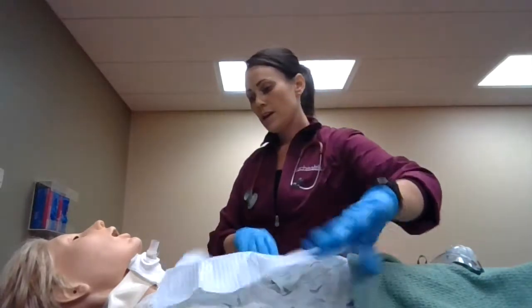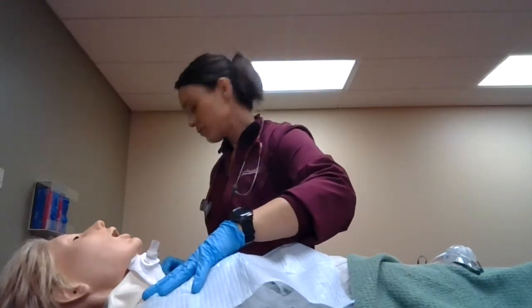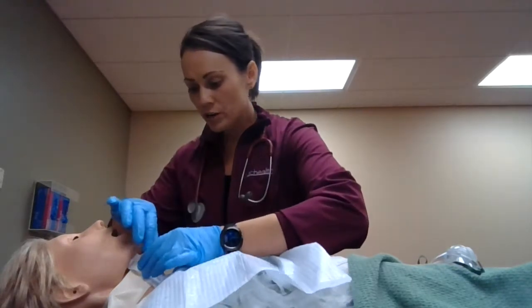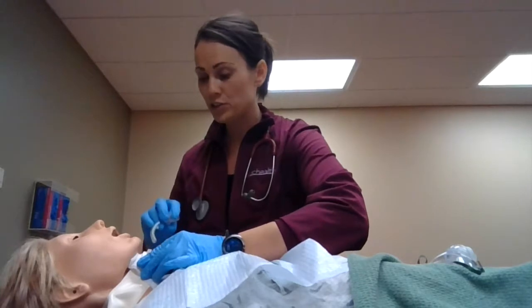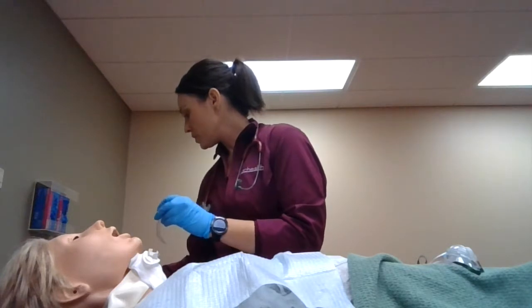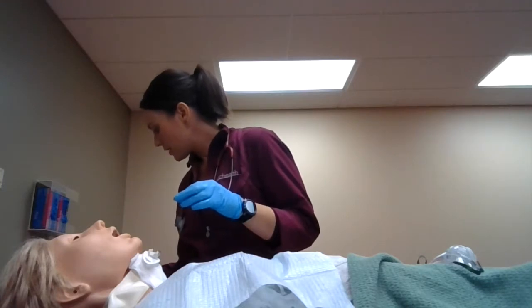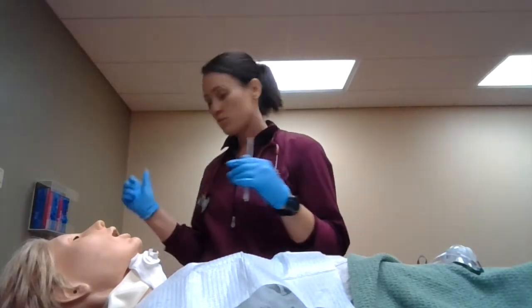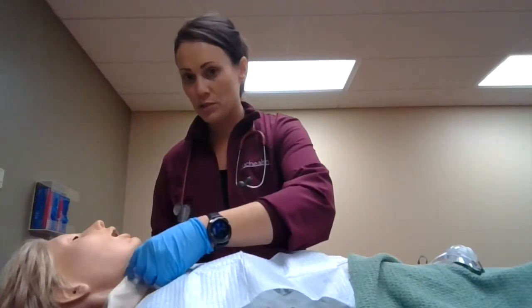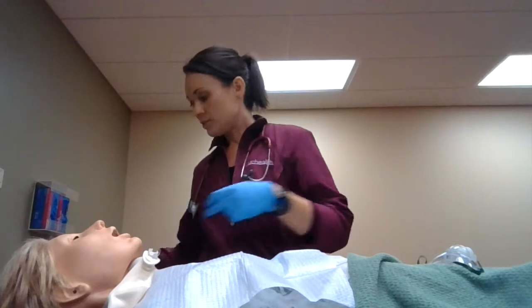We'll go ahead and lay this out and clean it up, Mrs. Smith. Are you comfortable? Good. I'll open up my care kit and go ahead and take the inner cannula out. I'm going to hold down that flange to make sure I don't pull out the whole trach. If the inner cannula is disposable, I can go ahead and get rid of it. If not, in my trach care kit we have a couple of buckets so we can clean it out with saline and let it air dry. Then I'll go ahead and untie the trach, always keeping a hand on it so it stays in place, and take out the gauze.